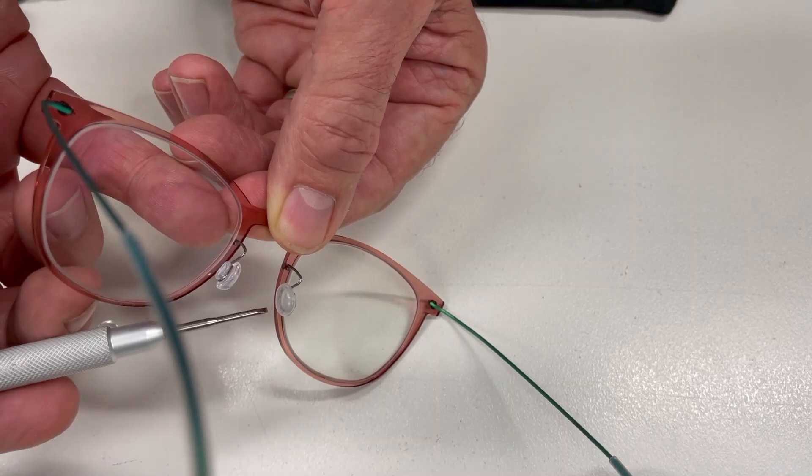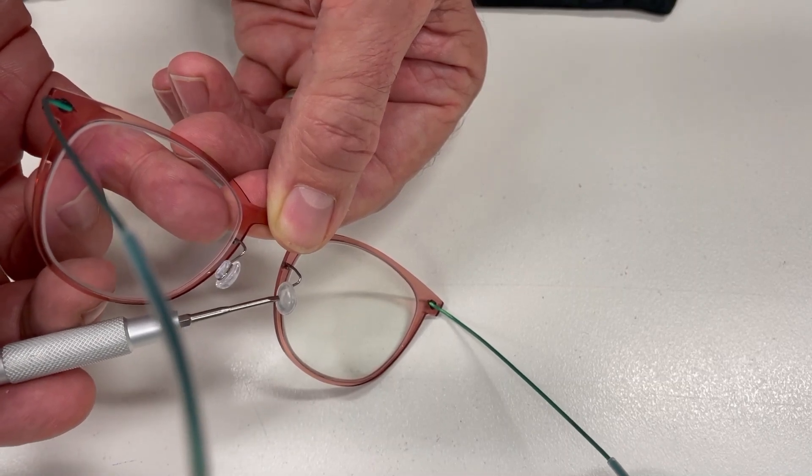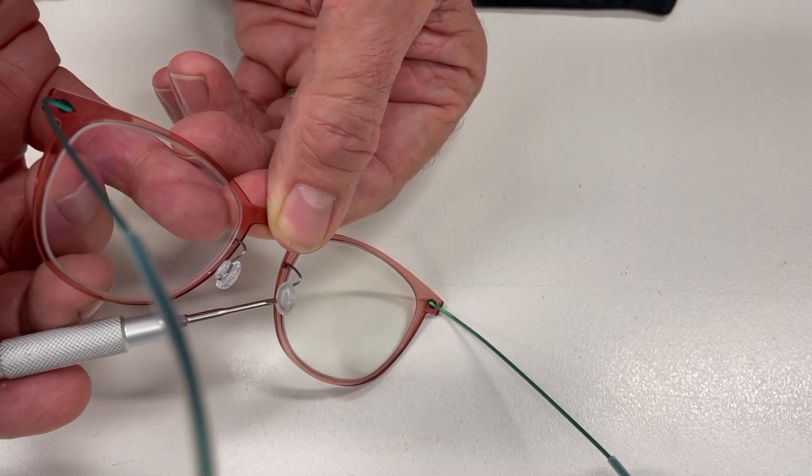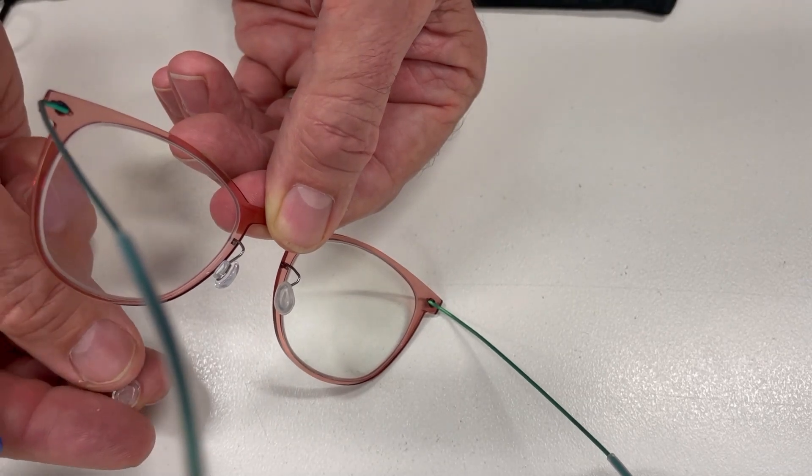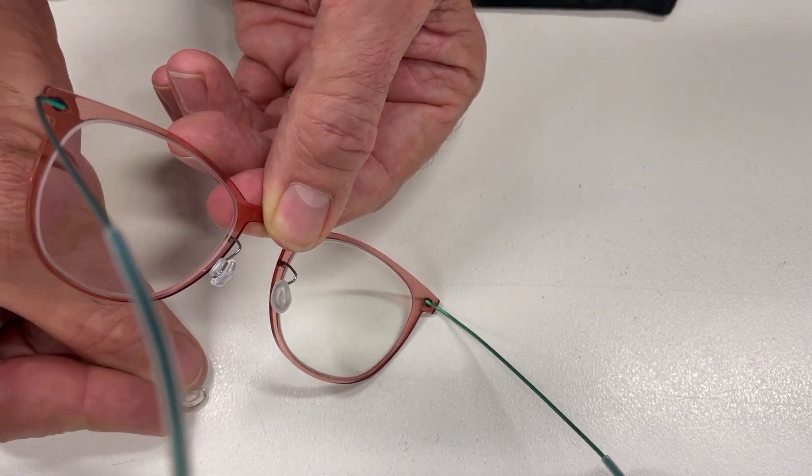You can see this one I've already changed. The other on the right-hand side is the one we're going to change—you can see it's a little discolored. The new pads come as a pair.